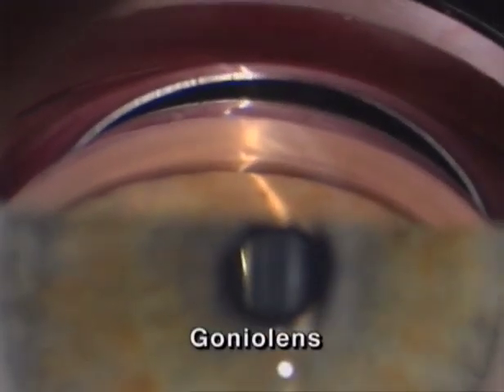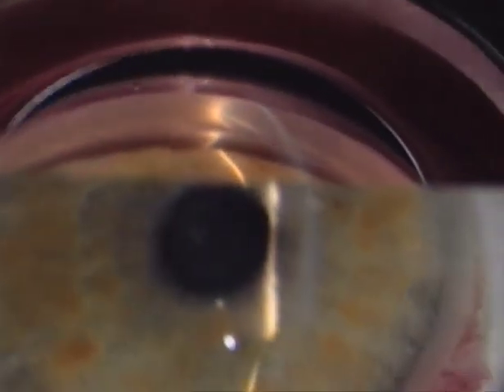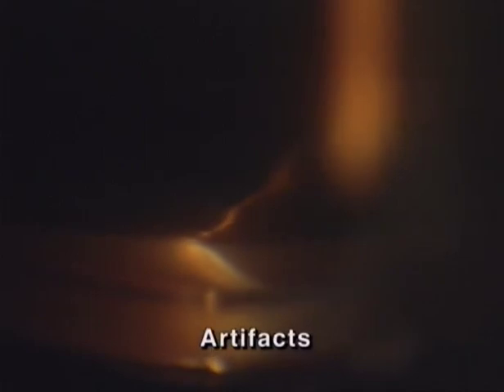If, instead, we use a gonioscope with an epicorneal mirror, there is still a discontinuity of the light slit showing the narrowness of the angle, but the view now reaches up to the ciliary body band. Always bear in mind that the contact glass may induce errors of judgment caused by artificial deformations of the angle.